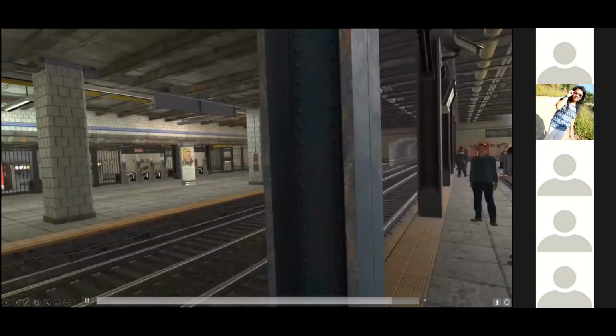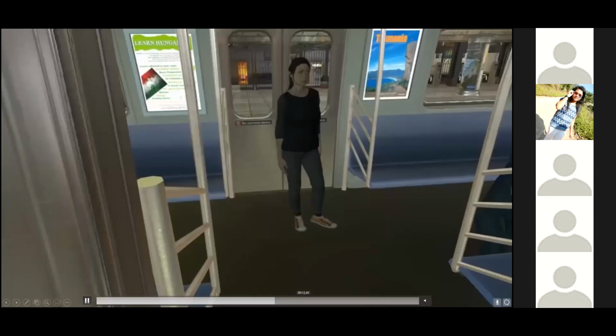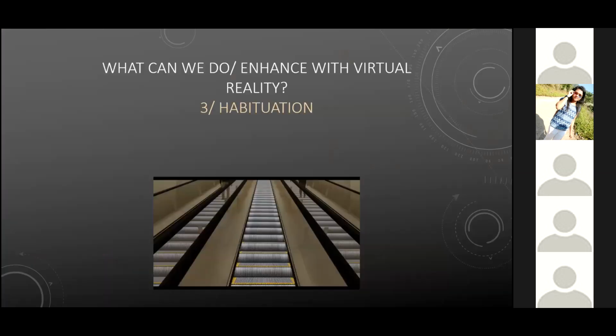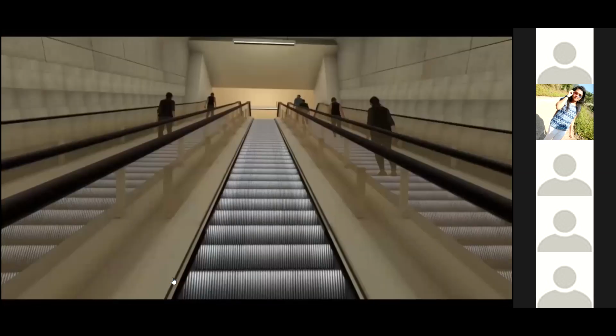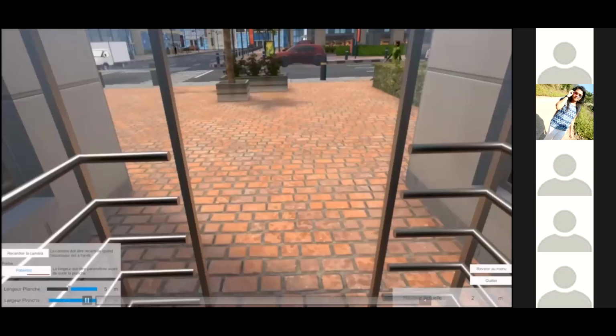So you go inside the wagon, and that kind of simulation is available for escalators or travelators as well. That's also for the visual flow and for risk of falls, because when you go out, you have a strong reaction at the end. Fear of heights, for example, acrophobia. So these settings are the worst you can do, but you can set everything: the transparency of the walls, the speed of the climb, of going down, the height, of course.